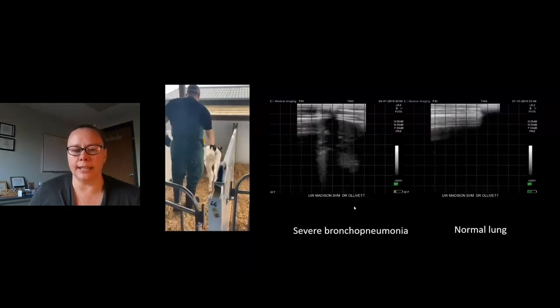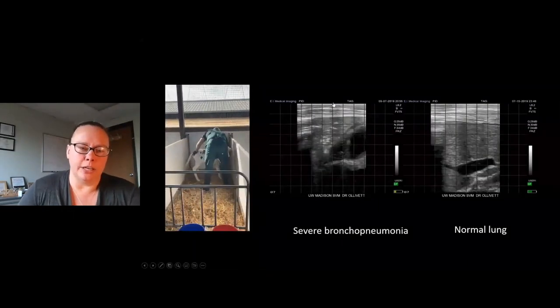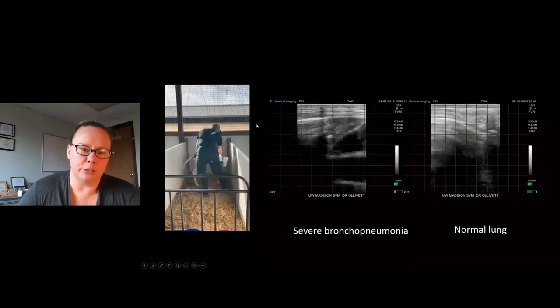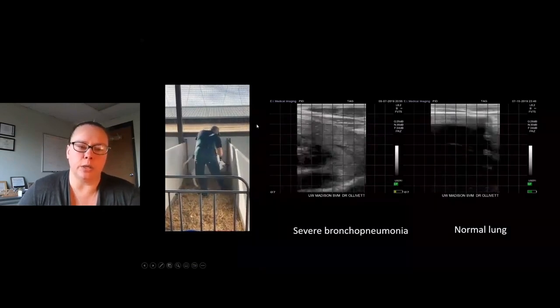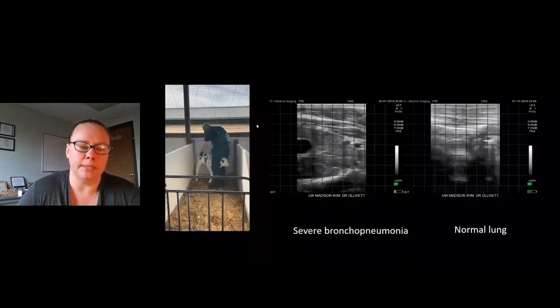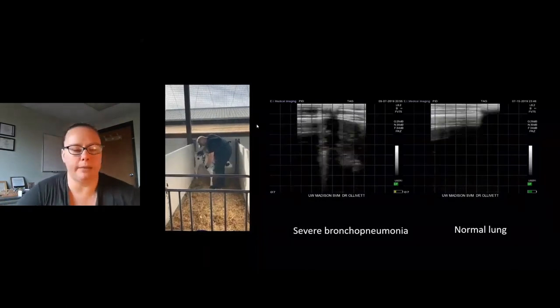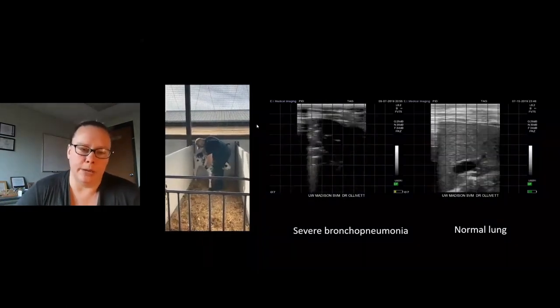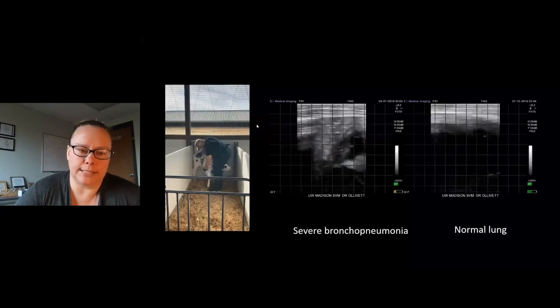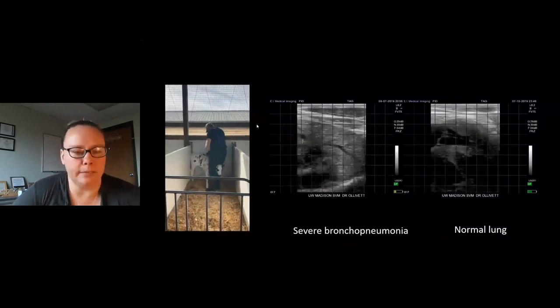So what am I looking at on the ultrasound? Here on the left, hopefully the video is playing for you. I'm just going to show you what it looks like to ultrasound a young dairy calf. So this is a one-man job. We restrain, we do the scan, and we enter the data into an app that we have on our phone. This is a student who, I think, is on his second day learning how to scan. By his third day, he's going to be even faster.